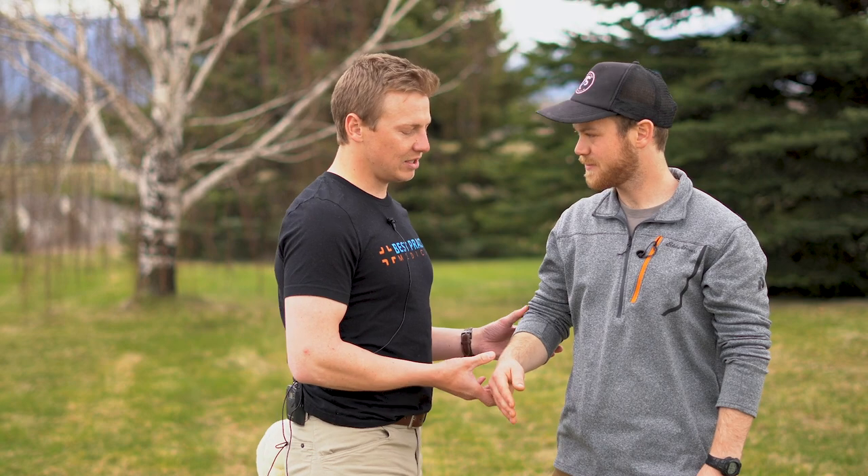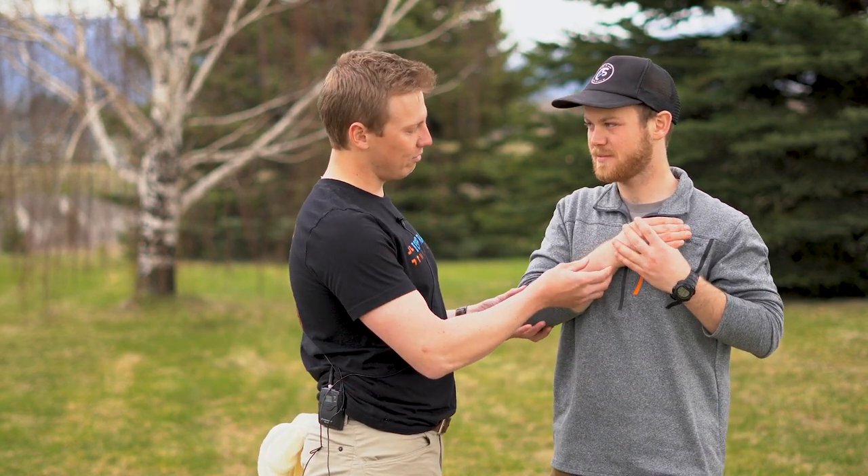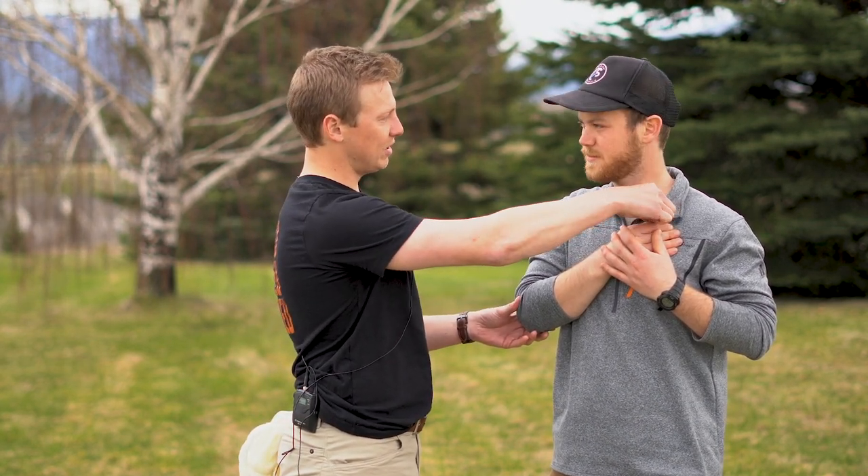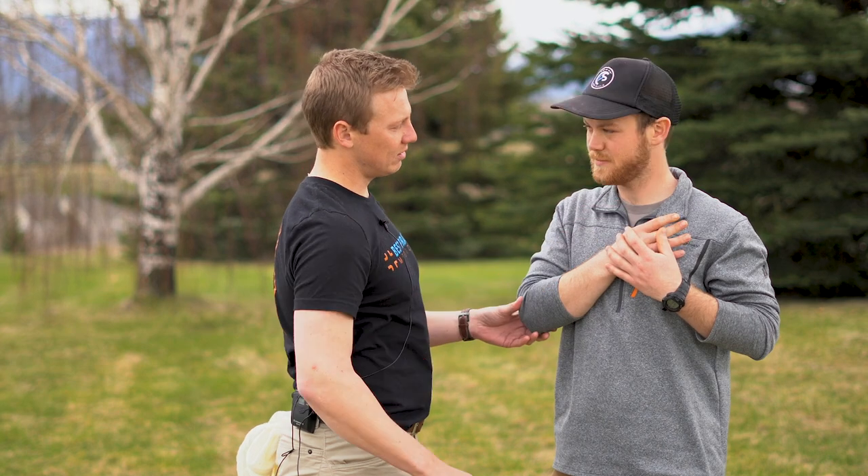As with any extremity splinting, the first step is to manually stabilize the injured extremity — can you hold your arm there for me — and to obtain an initial set of CSMs, checking for a pulse, sensation — what finger am I touching? My thumb — and motion — can you wiggle them for me? Awesome.